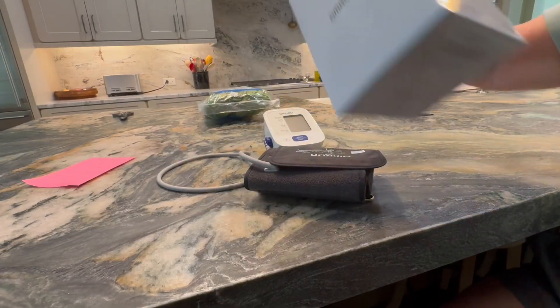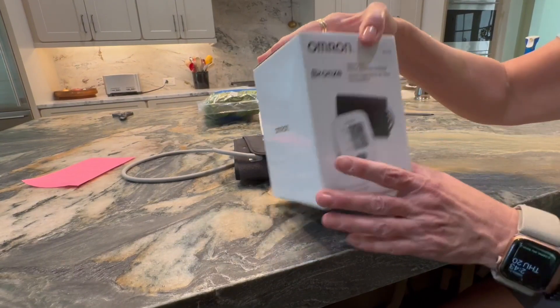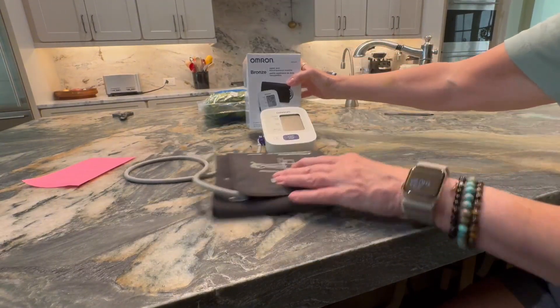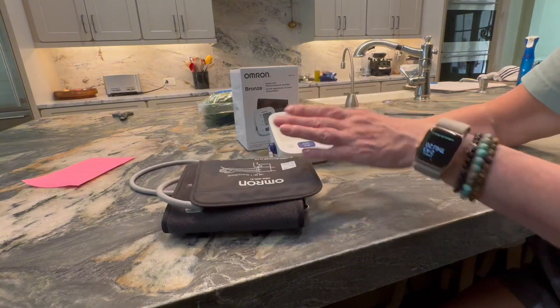Hey y'all, this is the Omron Bronze Upper Arm Blood Pressure Monitor and I really like this one a lot because it's so easy to use.